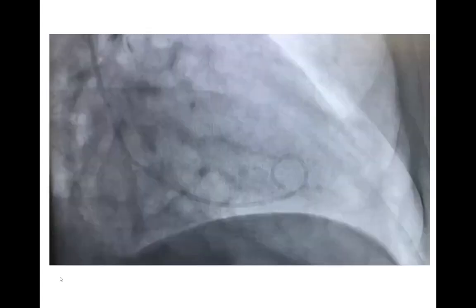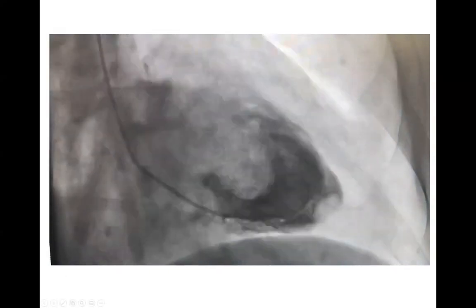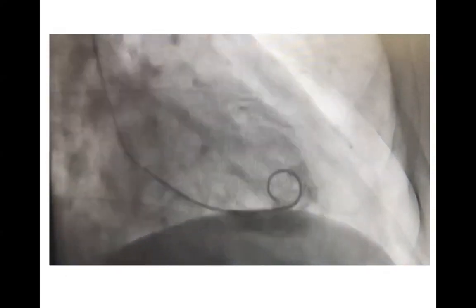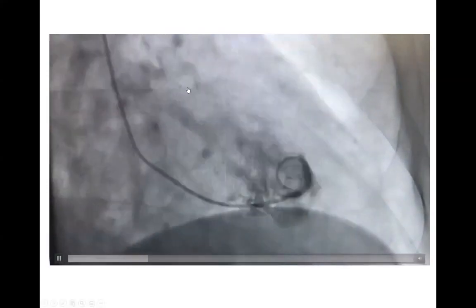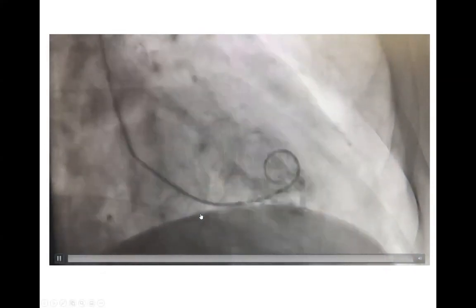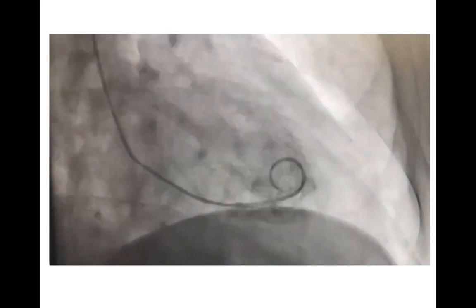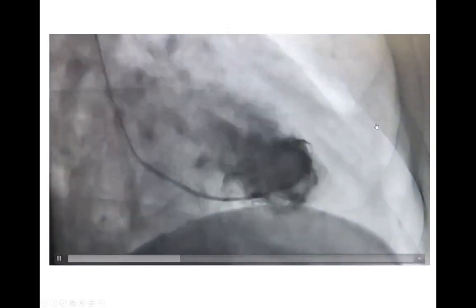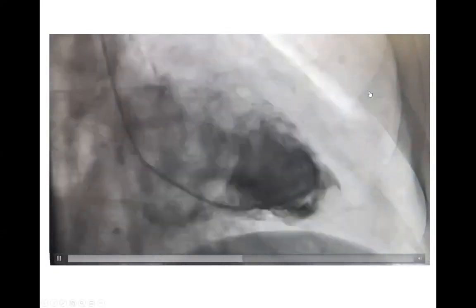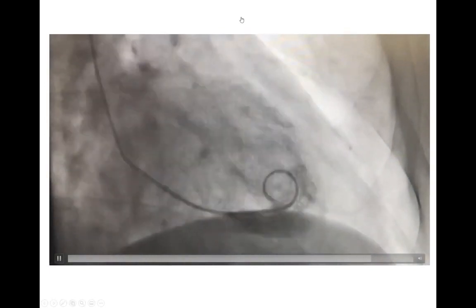I'm going to start by showing an LV gram. What do you see on that LV gram? I must tell you that the echo on this patient showed normal EF, no segmental wall motion abnormality. Anything interesting on that LV gram?